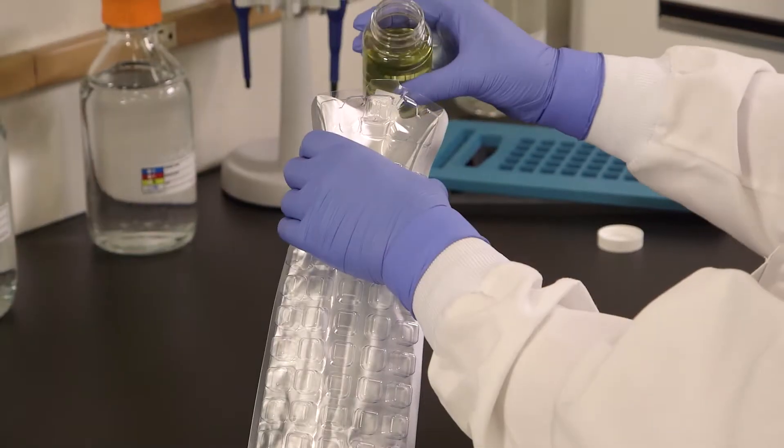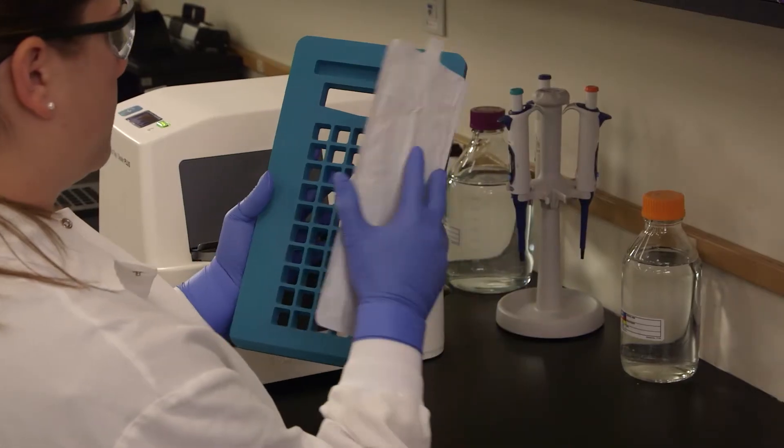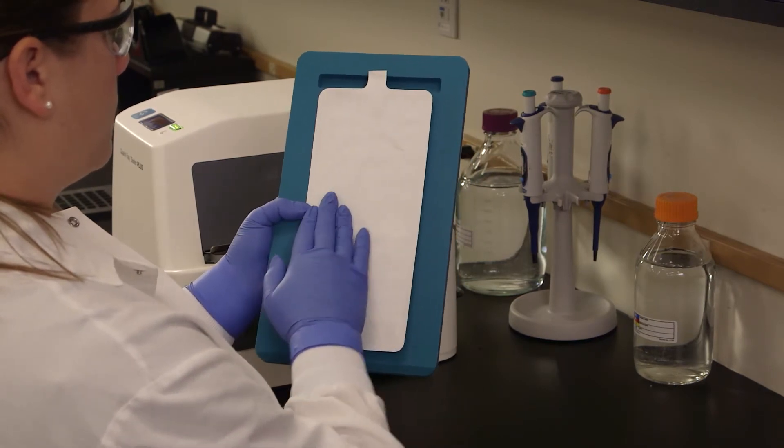Pour the sample mixture into the Quantitray, avoiding contact with the foil tab. Place the filled Quantitray on the rubber insert, making sure each well fits its corresponding hole.